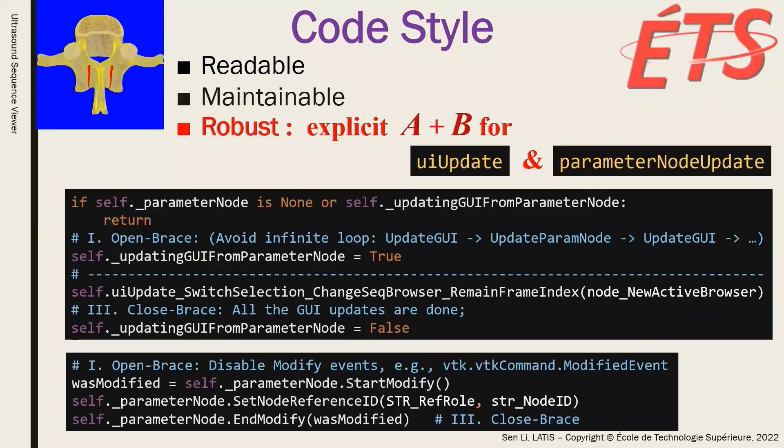The third rule to make our module robust is to explicitly define functions related to the update of user interface and the update of parameter node. Let me explain by starting from the update of user interface.